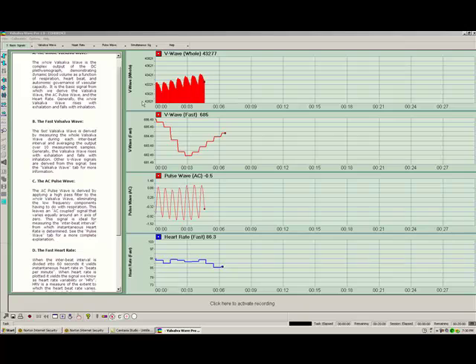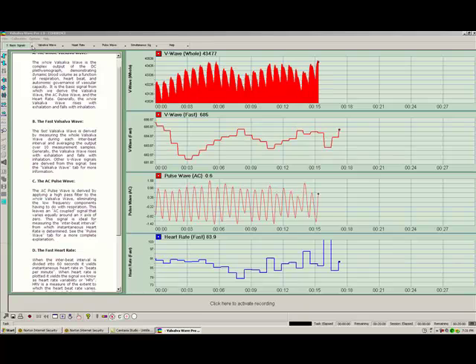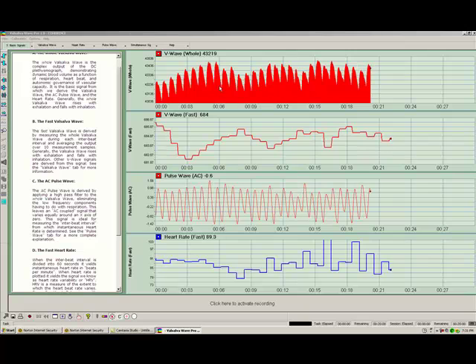When you hook up a sensor to a human being, I recommend that you come to basic signals, Let's get started option 3, and confirm that you see signals like this. You see a good whole valsalva wave. That is, you can see the heart rate is clearly present.